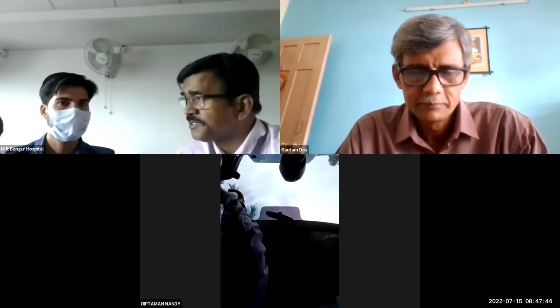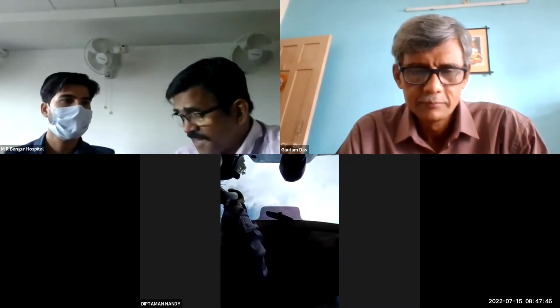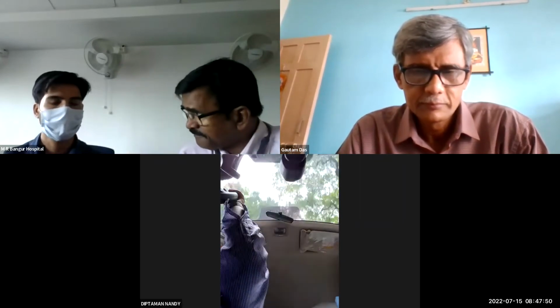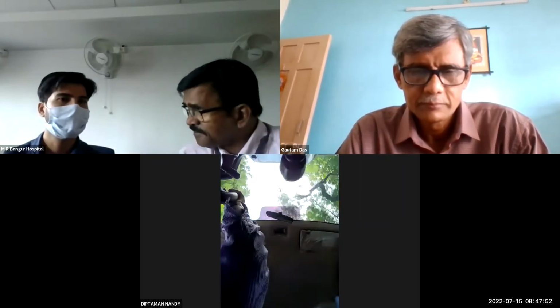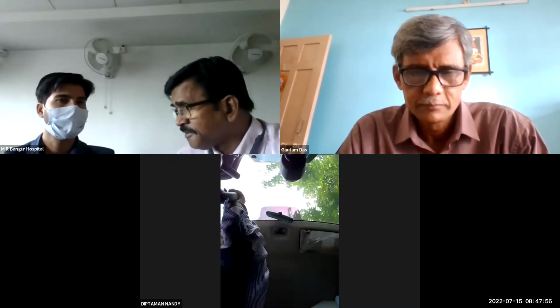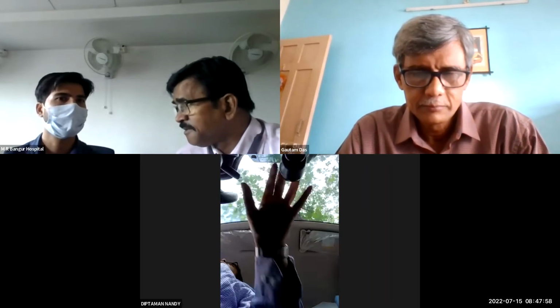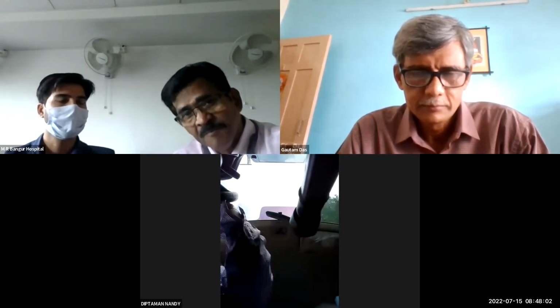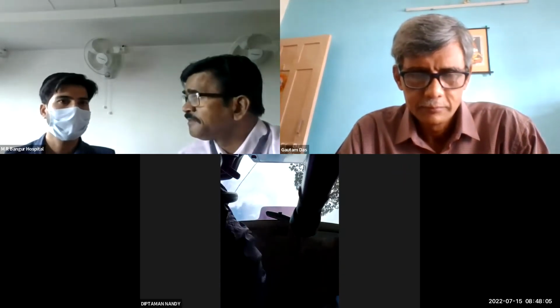Next, there is a complication related to the induction of the pneumoperitoneum itself. You are putting carbon dioxide. There are a lot of complications described with the stretching and the use of carbon dioxide. And then come the specific complications of cholecystectomy itself.